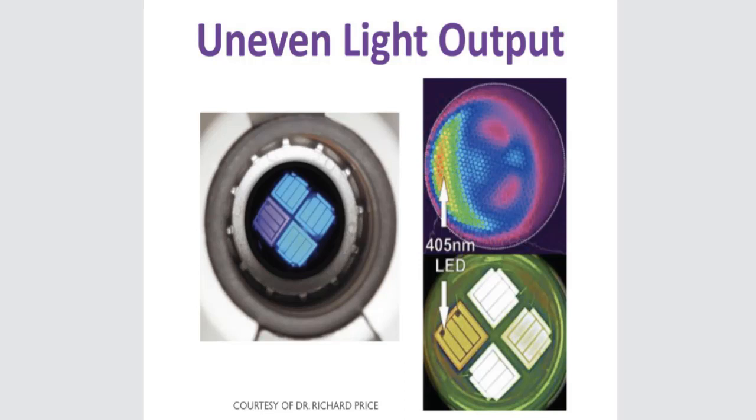We're talking about effectiveness, because all of our lights have these little diodes, okay? And depending on what spectral emission these diodes are doing, sometimes we'll have these dual output lights, and they'll have different wavelengths of diodes. Well, what we want is a good irradiance pattern of our diodes, because there's only so much real estate, a very small footprint, so it has to count.